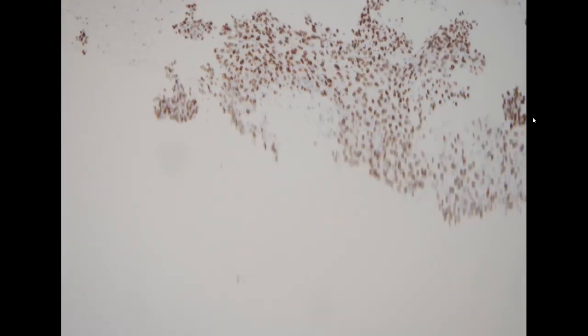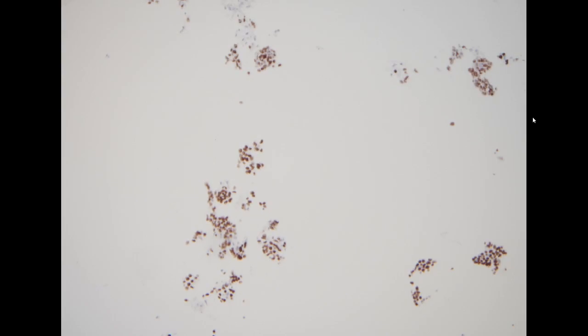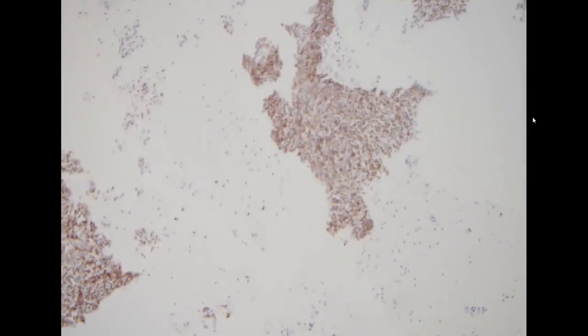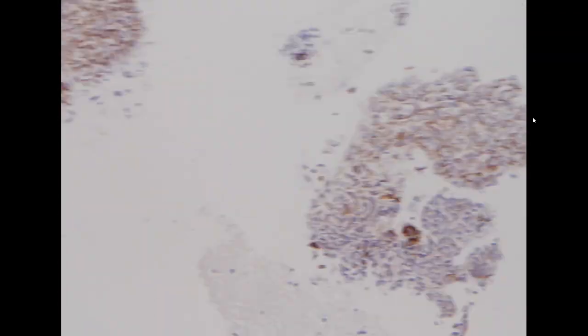P40 for myoepithelial cells is strongly positive. However, P40 can also serve as a squamous marker, so we need to pay attention to that. So we also did some myoepithelial markers. This is actin, and actin is also positive. So it is likely a myoepithelial carcinoma.